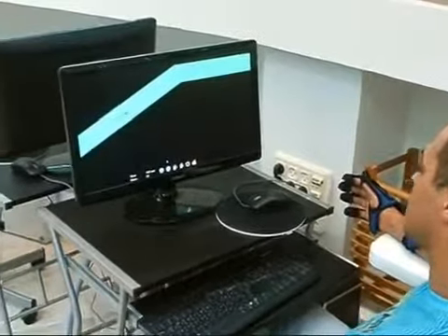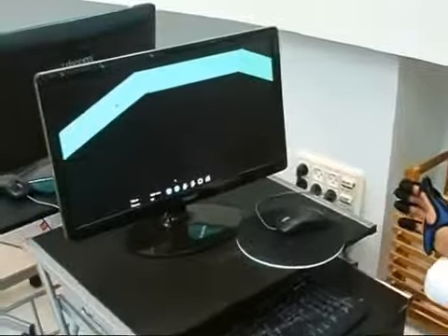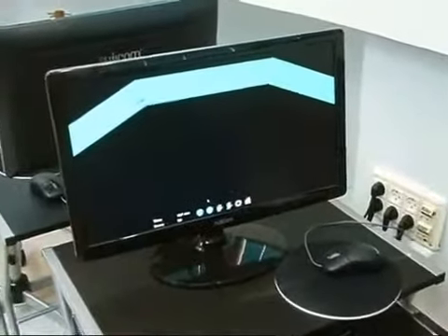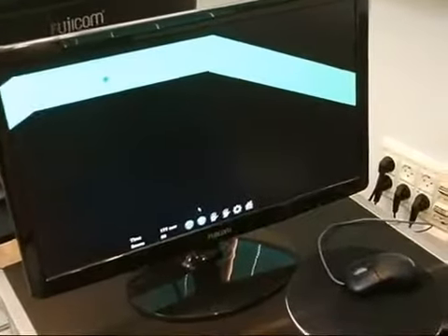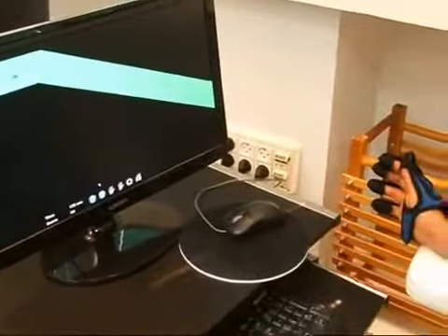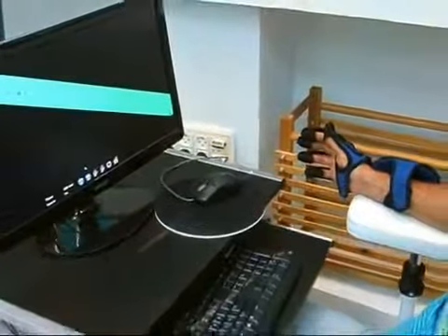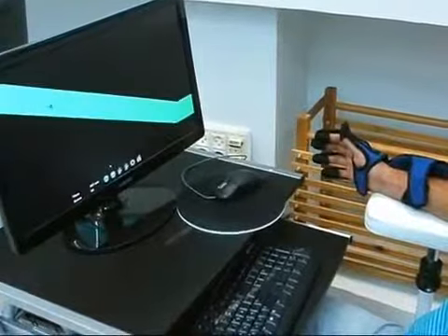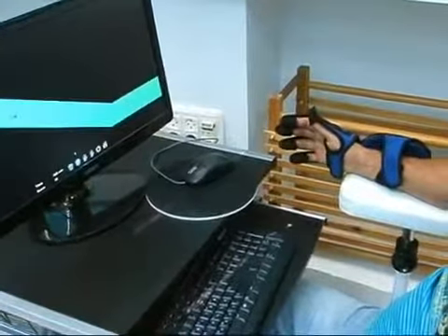The ArmTutor is an ergonomic wearable glove that detects finger and wrist movement. The ArmTutor uses dedicated rehabilitation software and is indicated for hand, finger, and wrist movement dysfunction following neurological or orthopedic injury and disease.